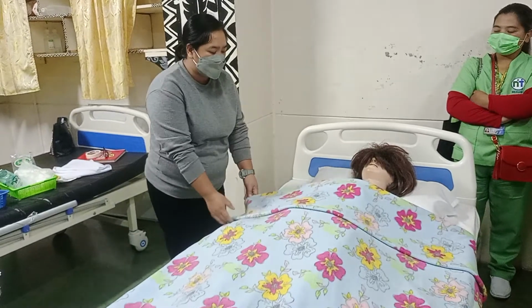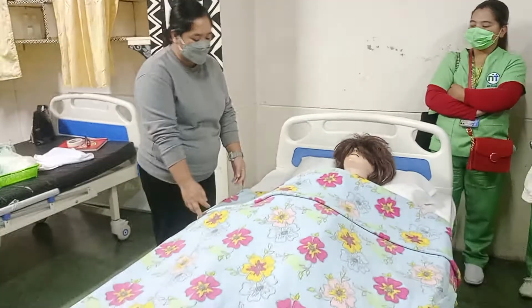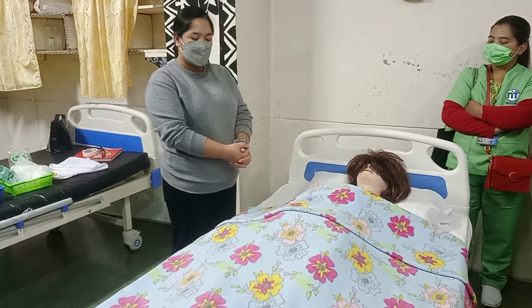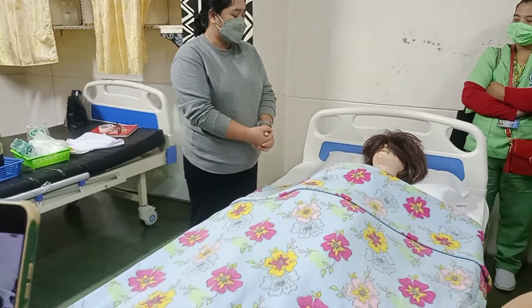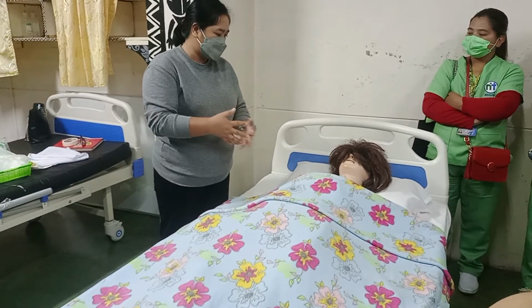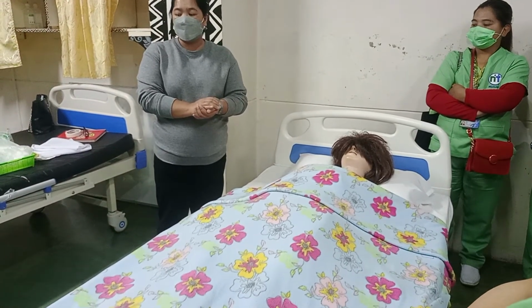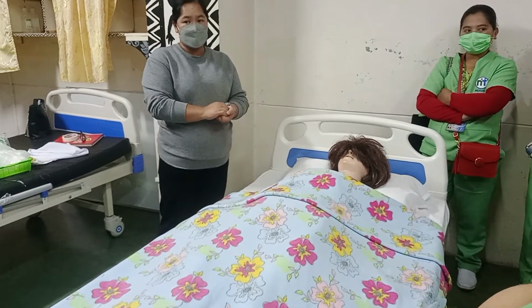So, now, I am going to insert the catheter, and while doing the catheterization, I will be touching your perineal area in some parts of your body. Will that be okay with you, ma'am? Yes, okay. Are you okay if we start the procedure now, or would you prefer to do something else before we proceed? No, okay na daw ngayon. Okay, so thank you for allowing me to do that. I will exit your room, prepare my equipments, bring it in your room, and we will begin with the procedure.